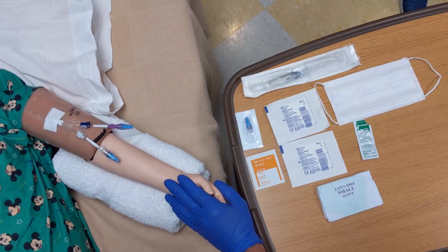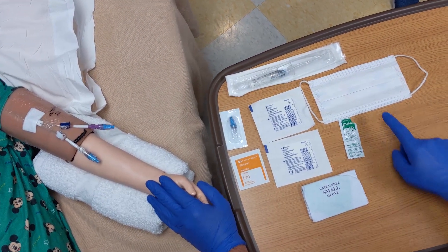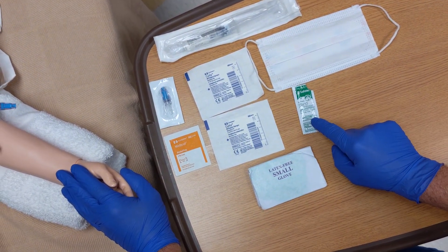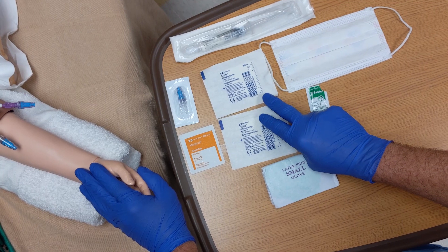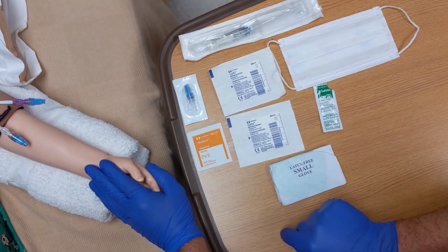The first thing you want to do is get your kit together. You want to gather a mask for yourself, your assistant, and the patient. You want to have hand sanitizer readily available for hand hygiene, a pair of sterile gloves, two sterile gauze, an alcohol swab, a sterile cap, and a sterile saline flush.